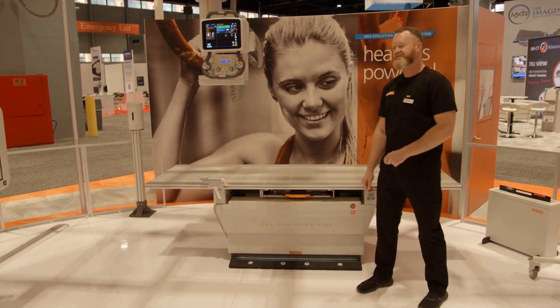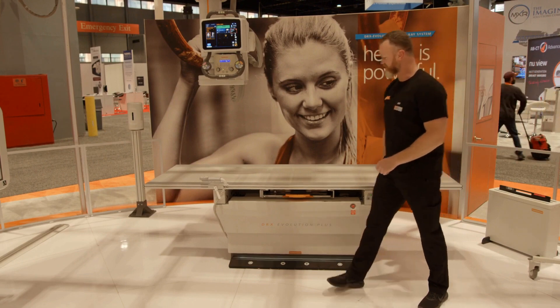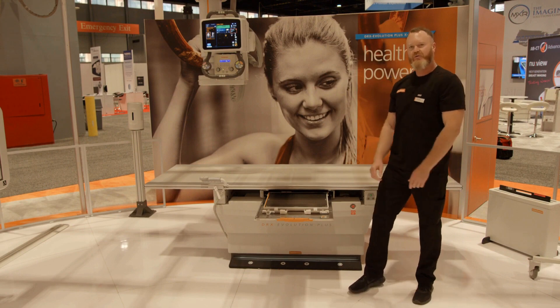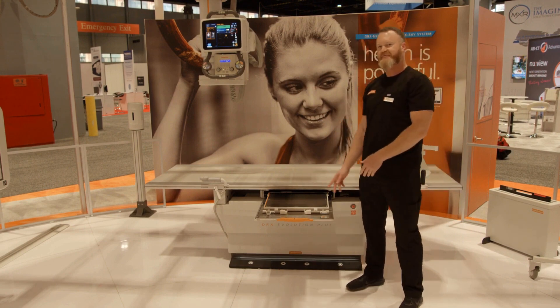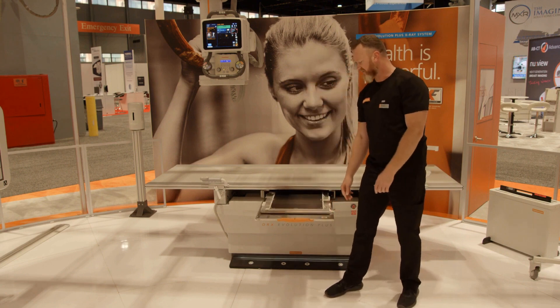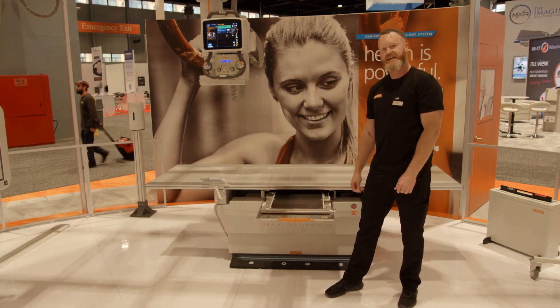We also have a rotating bucky tray. This bucky tray will accommodate both the 14x17 and 17x17 detectors. It functions very much like the compass rotating bucky tray.